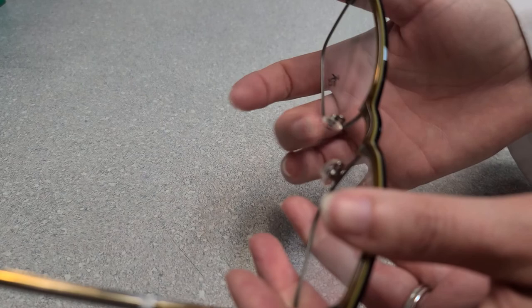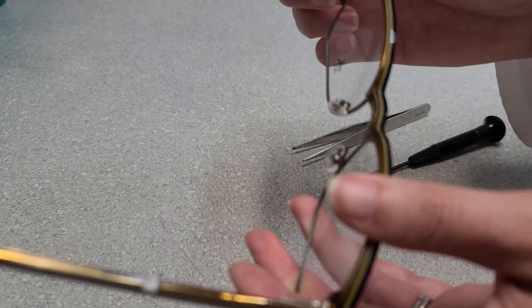All nose pads have a little bit of a wiggle. This is designed to allow it to sit on your nose more comfortably. And that is how you change a set of nose pads.